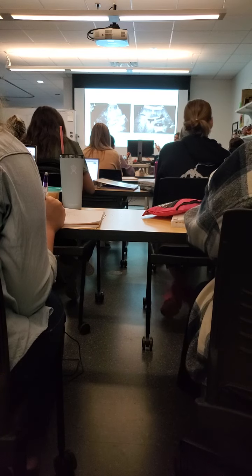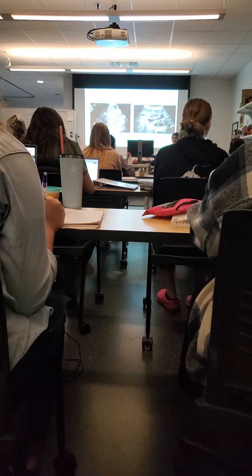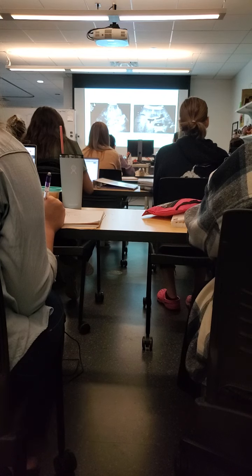So, most likely metastasis. And meds can look a lot of different ways, right? You guys understand meds metastasize, right? All right, how about this image? Yep, hypoechoic.